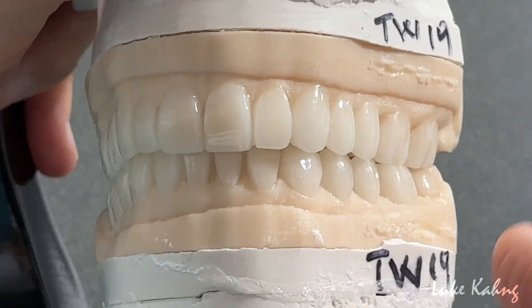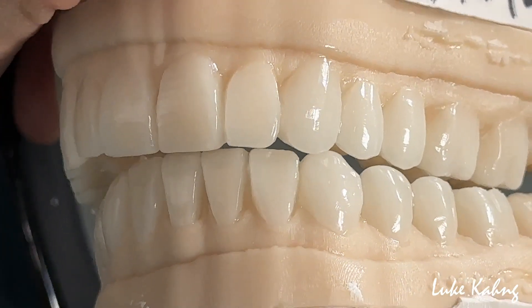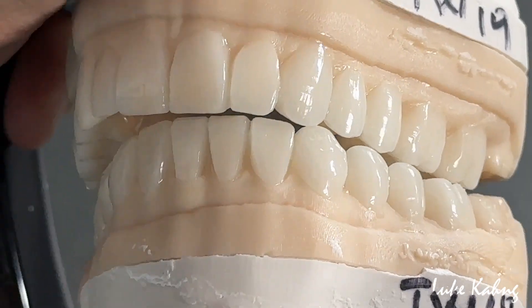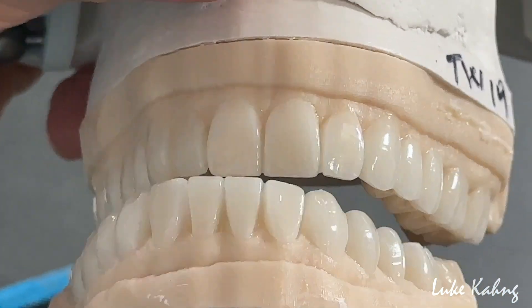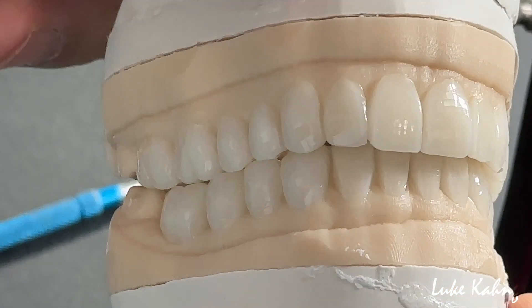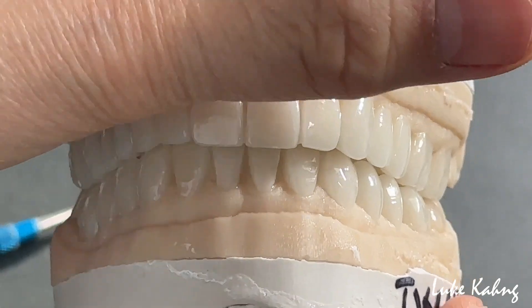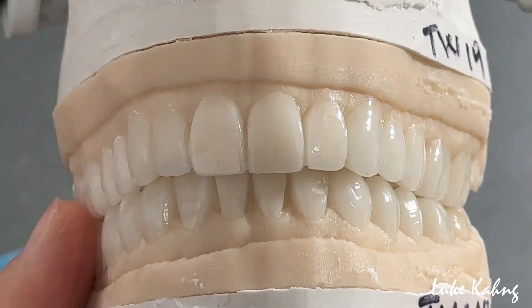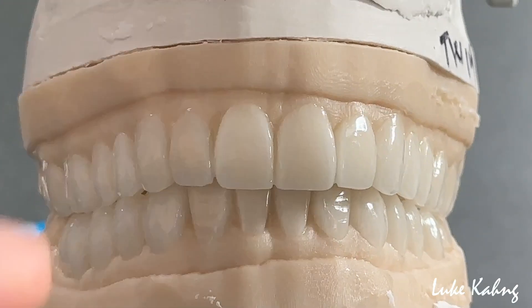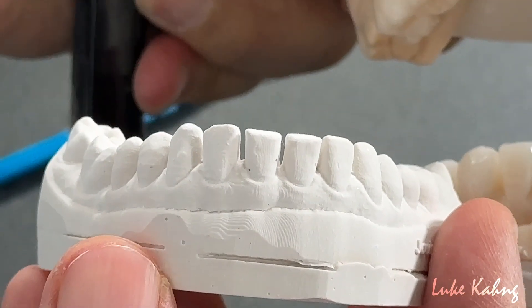I match whenever they are smiling — here is the guidance, it's important. Non-function on the other side, not touching the incisal teeth — that is another guidance. Whenever they move from protrusion, non-function on the other side. Moving to canine to canine, I can get only canine rise — it's not touching the other side. Whenever the patient is smiling, I want to see a good buccal corridor design, not too high, no interference. Once I set up this and it looks good, I can set up the midline together, and then the lower teeth — open space, all open space — so I close it.